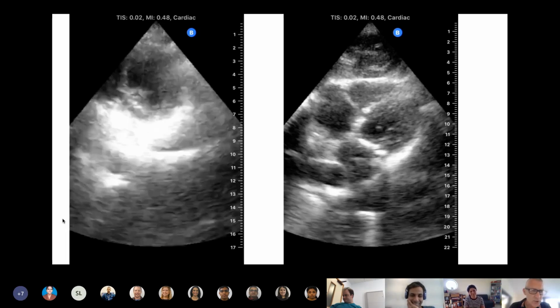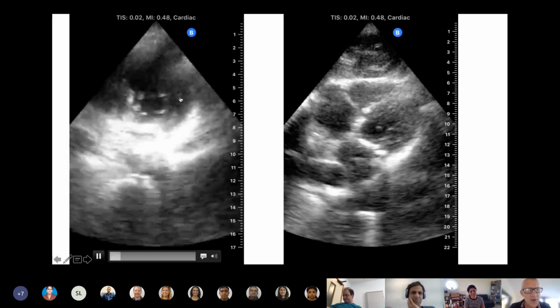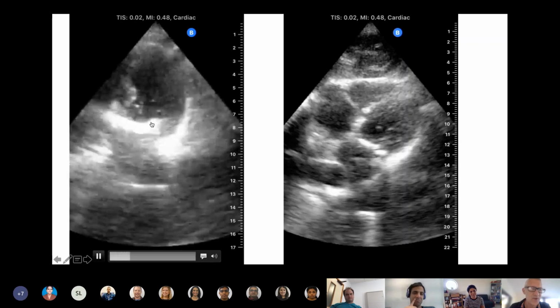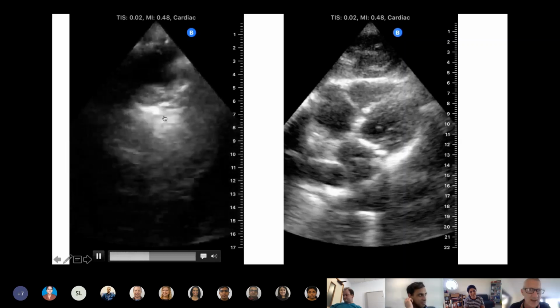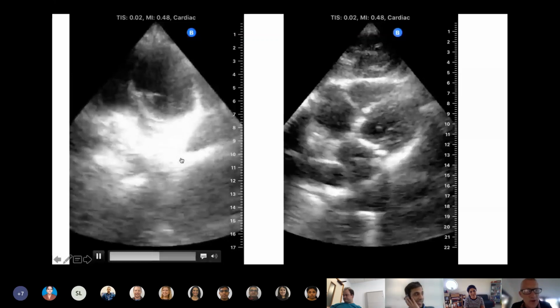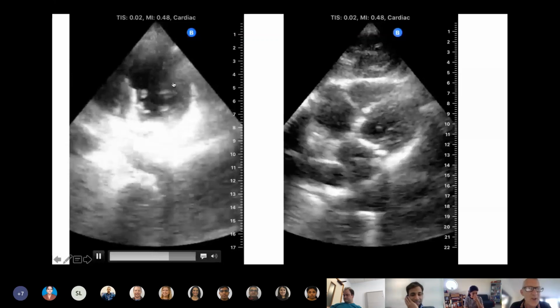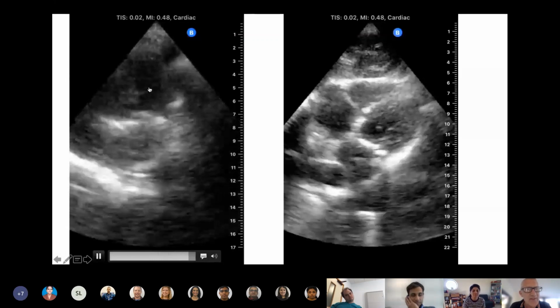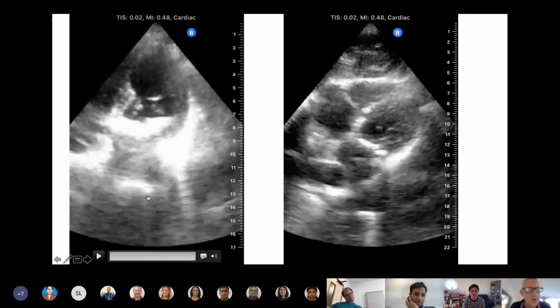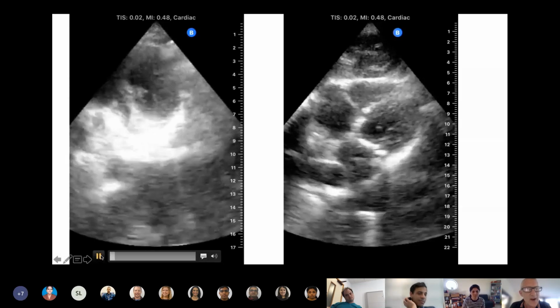So this is a short axis view where you're cutting across the left ventricle. And again, she's sitting forward. I'm trying to get a position where I can see some papillary muscles on the left side. There's a bit of movement. She's not that happy with it, but we can see that the left ventricle is there. We don't have much septal movement. It's not the best picture in the world. I definitely grant you that.